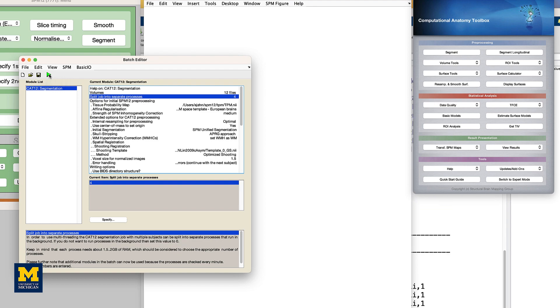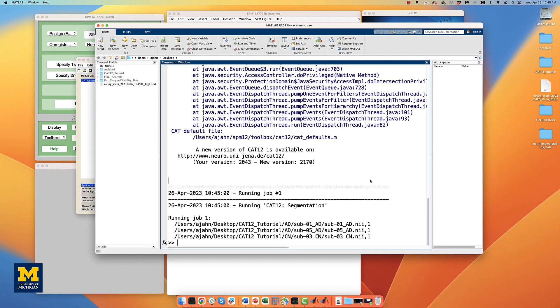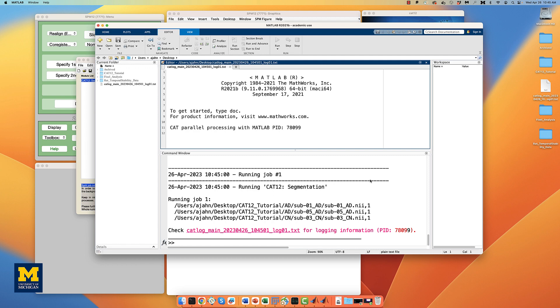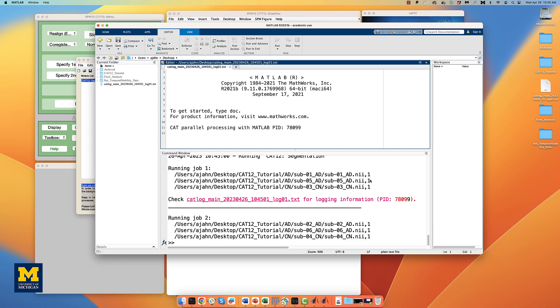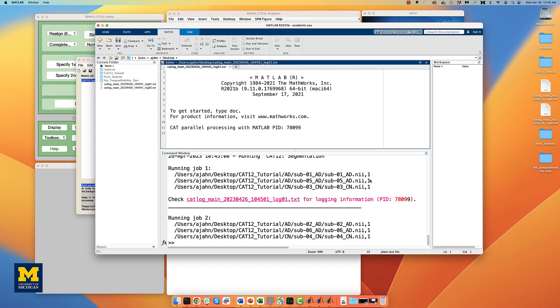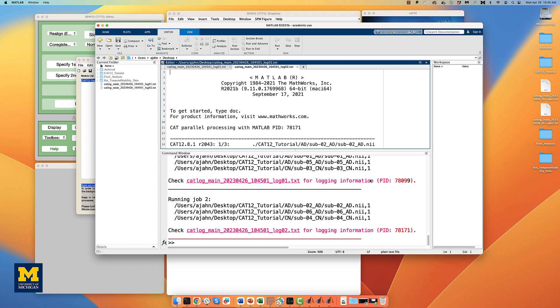Note that there will be 4 instances of MATLAB that start running and start analyzing the data. Three subjects have been assigned to each processor, and the subjects currently in each processor's queue are being analyzed simultaneously. This is a preview of what we will be doing on a much larger scale when we analyze more subjects using the supercomputing cluster.